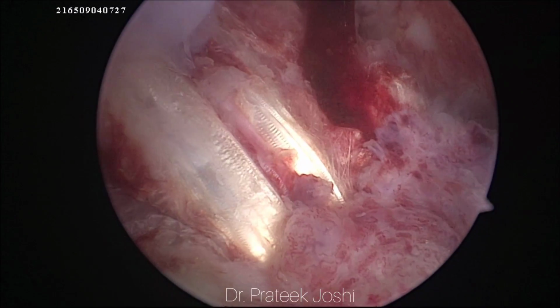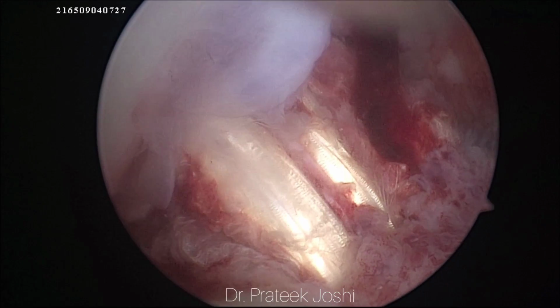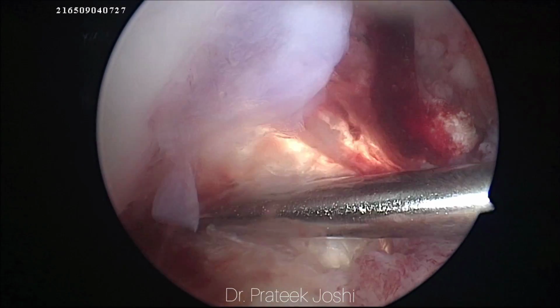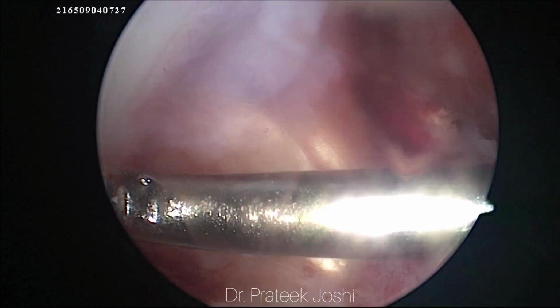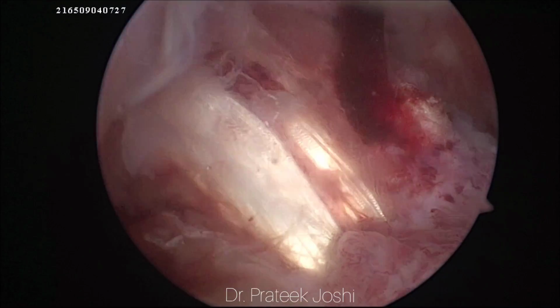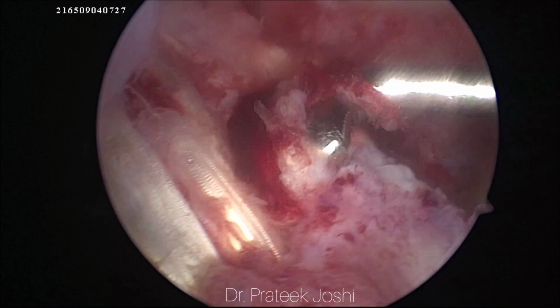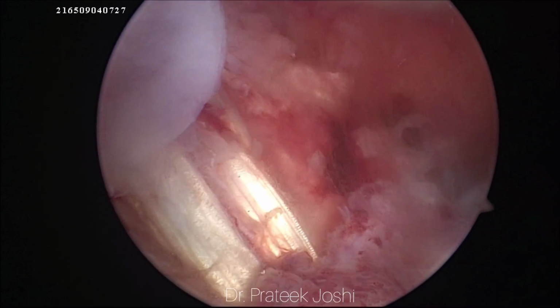After this step, we cycle the knee to tension our graft throughout the range of motion, and then we fix the graft at the tibial end with the help of an interference screw while keeping the knee in 30 degrees of flexion and giving a posterior force over the proximal tibia while tightening the screw.